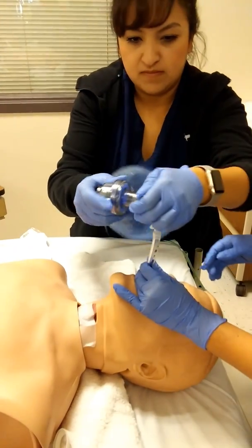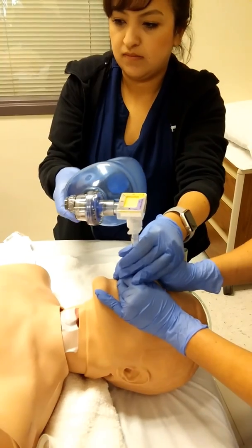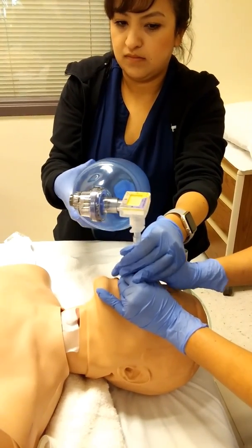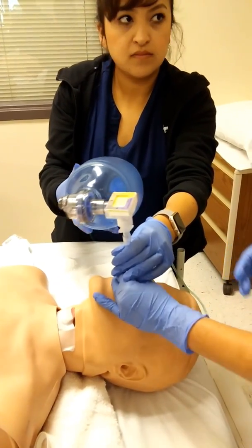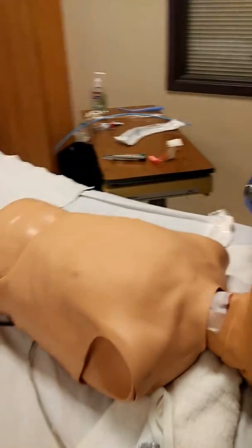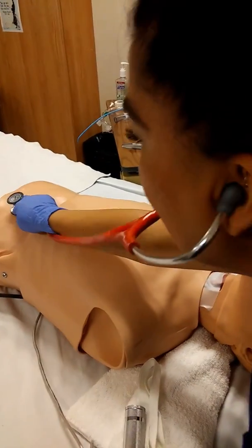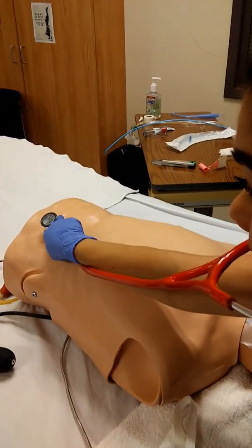If you could just hold the tube for me, please, while I check. I can already tell that there's a rise in the stomach. So I would listen, and I could see that I did not get the lungs.